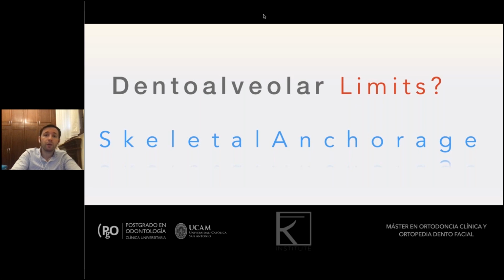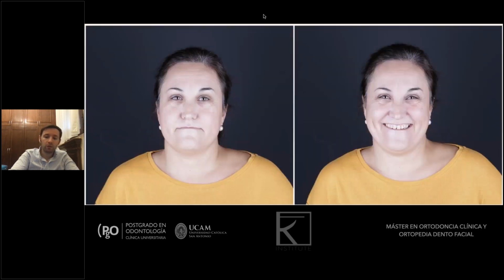Okay, it's perfect for me. I'm going to put you 4 screws and I'm going to spend 1 year. Okay, it's easier to say, hello patient, I'm going to put you 1 motion and then brackets or then aligners, and in 1 year I'm going to finish you with no screws, with no surgery, with anything. Okay, the patient is going to say, I prefer no screws for sure. So sometimes we need, okay, sometimes we need the screw. In this situation, I need the screw. Okay, why? Look at.